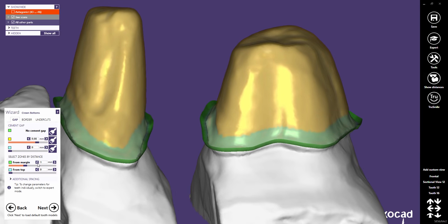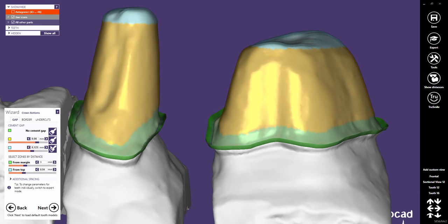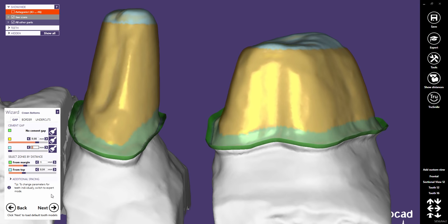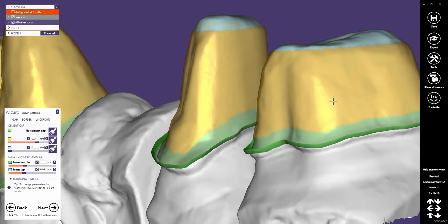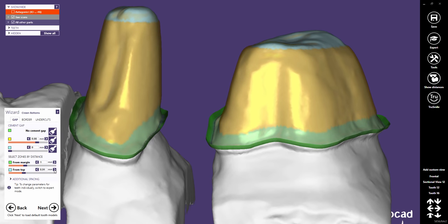Now you can even define a distance for the blue area from the top. You can again adjust the cement gap thickness in this zone. The blue cement gap zone will disappear if you choose zero as a distance.